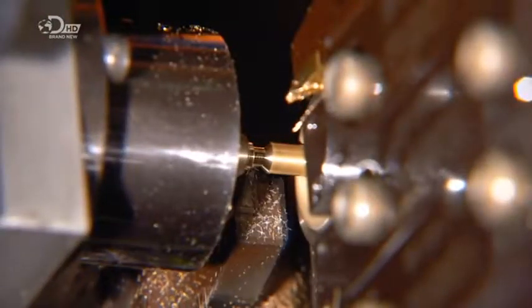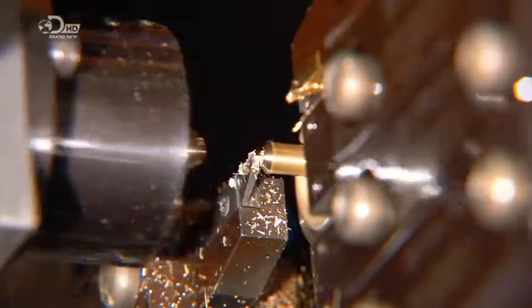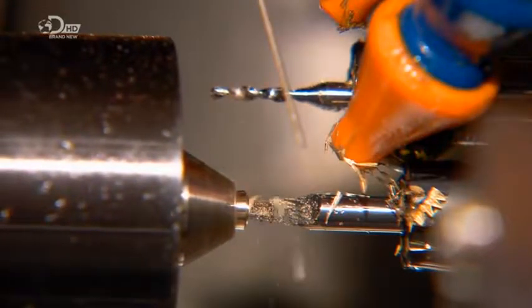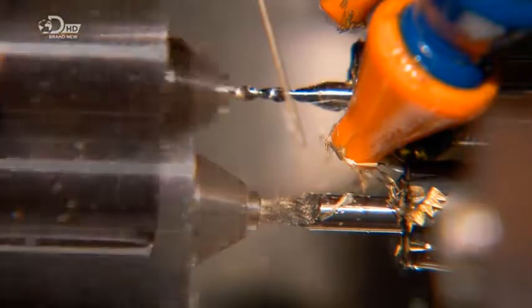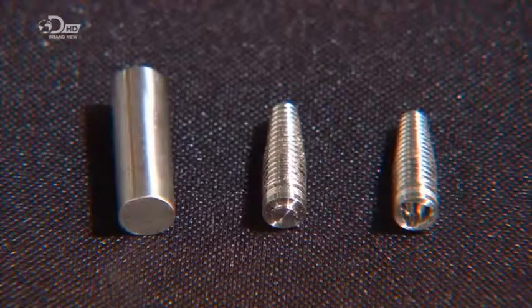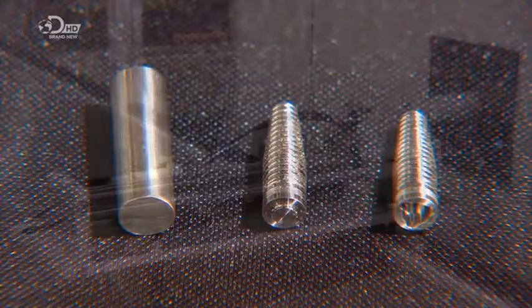A tool now grips the implant while another cuts it to length. Then a computerized drill hollows out the implant and carves threads inside for attaching the ceramic tooth. In minutes, a solid metal cylinder becomes a hollowed and threaded implant.